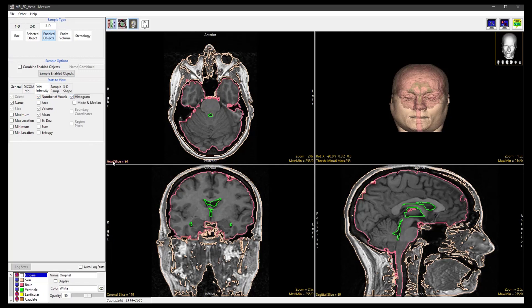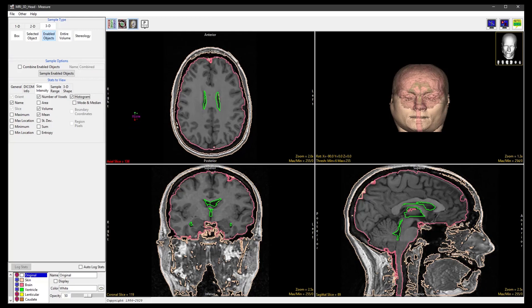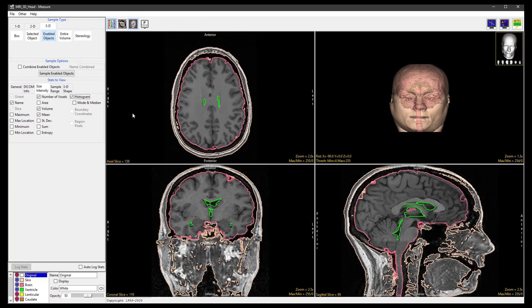In the axial orientation, select a slice that displays the upper brain near the ventricle region. We will only generate the histogram for a single object, so choose Selected Object and check the Auto Log Stats checkbox.